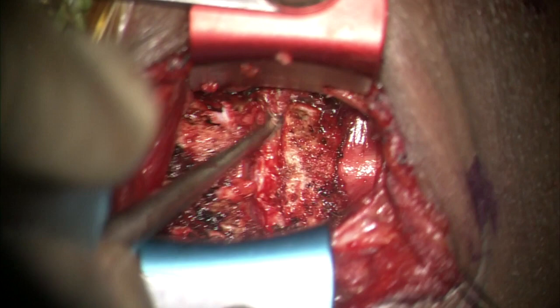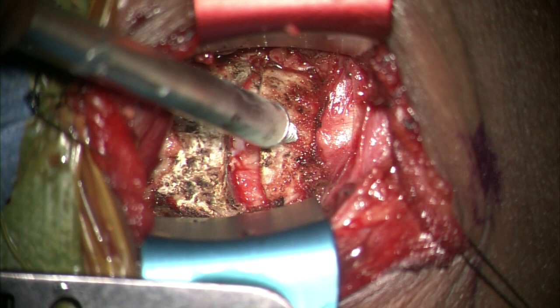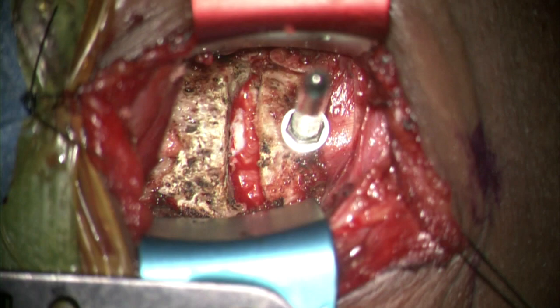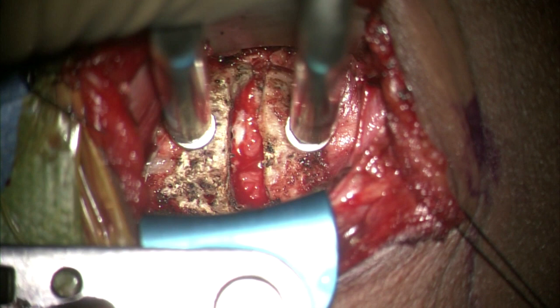Disc material is scraped off using a curette until the uncovertebral joints are clearly visualized. Using the midline and the orientation of the endplates as reference points, Casper distractor pins are placed and the disc space is gently distracted. The remaining disc material and the posterior annulus are removed, helping to identify the vertical fibers of the posterior longitudinal ligament.